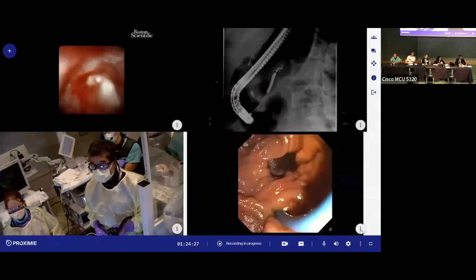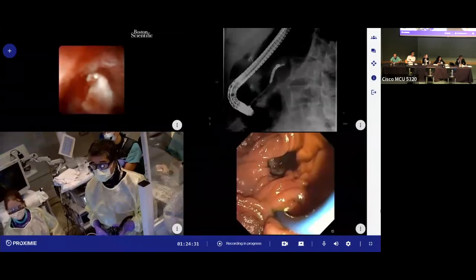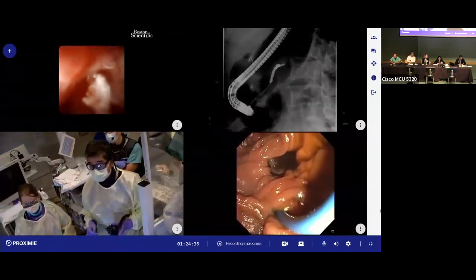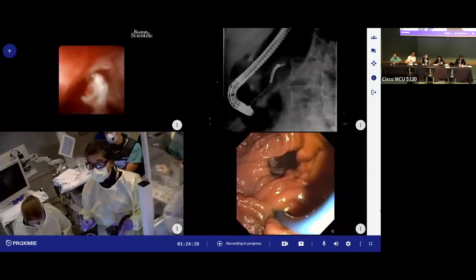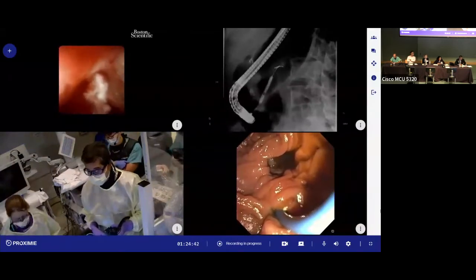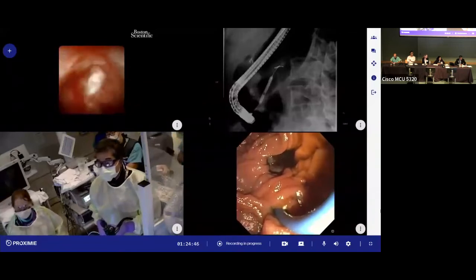And then we're balloon dilating. Balloon dilated almost up to the stone, but you can't get any contrast above the stone. I want to emphasize that. There is no contrast above the stone. Down there, so we dilate. We have the SPY pancreatoscope in now, irrigate here, and we have lasers set up.